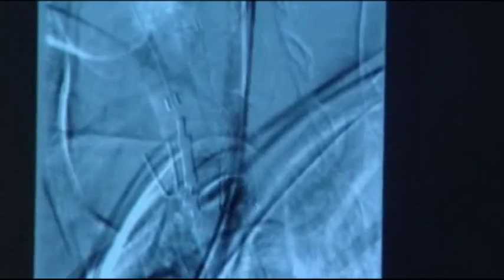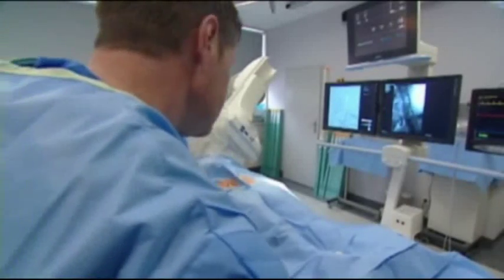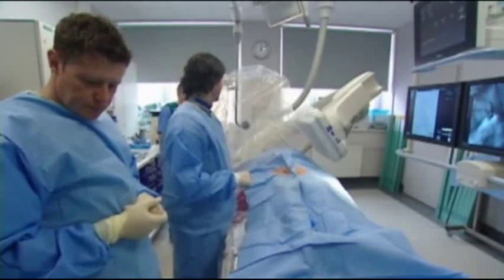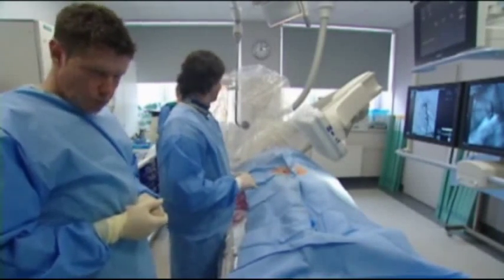Yes, we have implanted the stent, and now we'd like to check the influence on the outflow. There is no reverse flow. The flow is directed to the heart now. The stent is in a good position. And the reflux? The reflux has gone. Ginger, we are ready. Are you happy with that? We're all done? Yes, we are done. Yes, very, thank you. Yes, you're welcome.